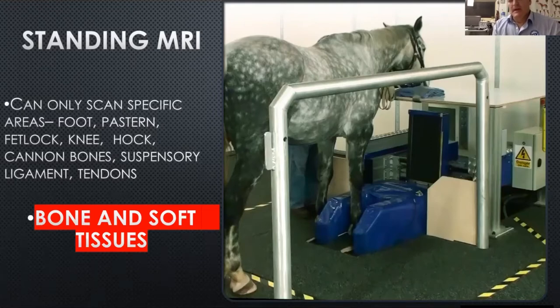There are lots of incidences where people have forgotten and walked in with anything that's metallic. Once you get inside this black and yellow line, if you've got a shoe and hammer in your hand, it will fly to that magnet and stick to it. You can slide a hammer off relatively easily because it's a small face, but it's really quite dangerous. We don't let people in there with pacemakers, and mobile phones are not allowed either.